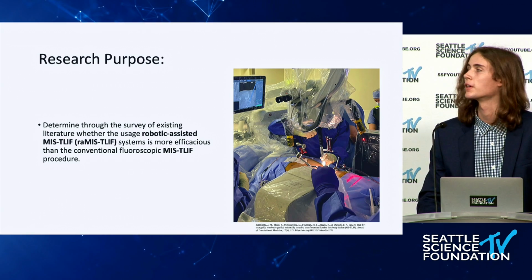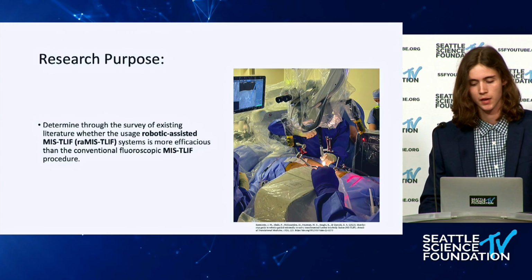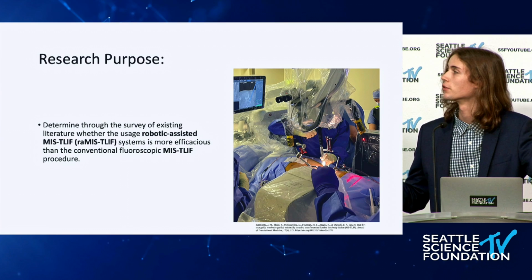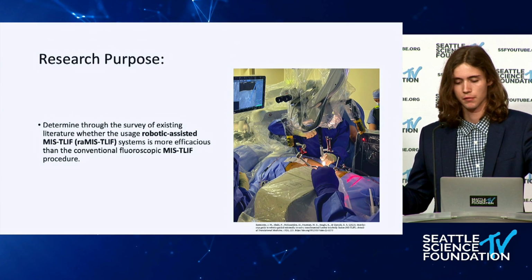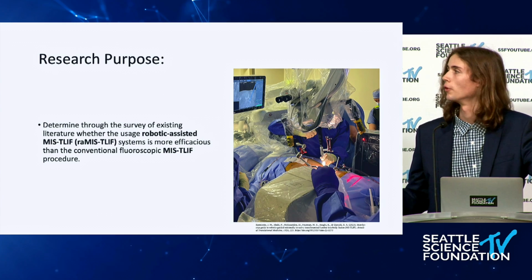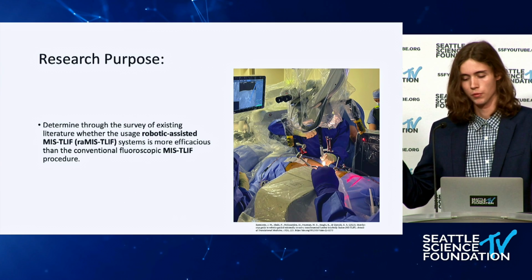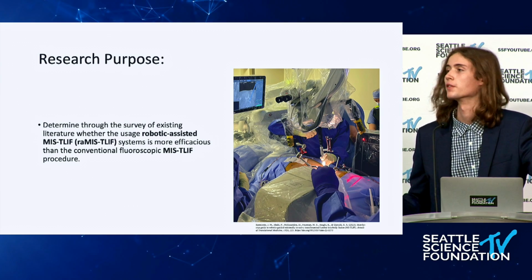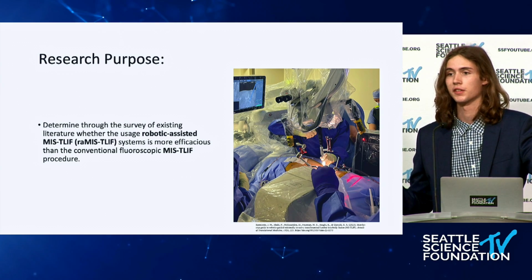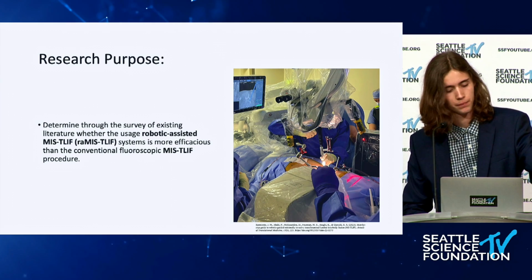This is important because proponents of robotically assisted surgery have proposed that it could reduce the risks to patients during procedures and possibly result in better outcomes. So for patients who would normally have similar experiences like our case study patient, robotically assisted surgery is theoretically capable of mitigating that risk.